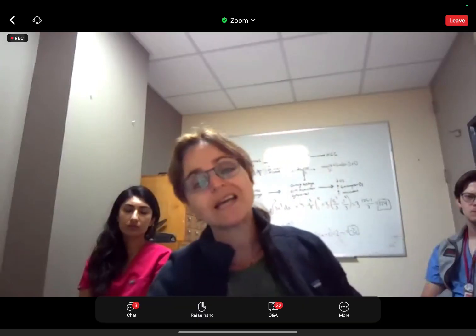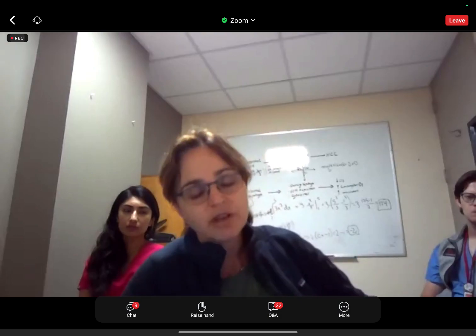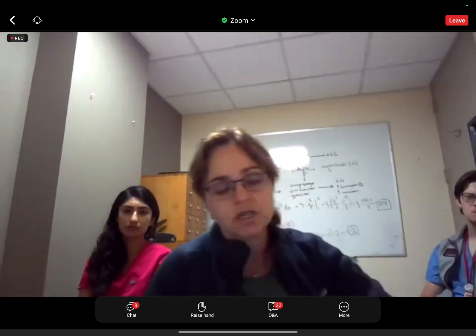So there's a manual that is available to everybody from the ACR website, and it has an entire chapter on LI-RADS techniques. So all the details are there. But the current technique recommendations are to have b value of 500 or above. Now, this was a sort of a compromise because ideally you really want to have b 800 and higher. B 500 is really insufficient.